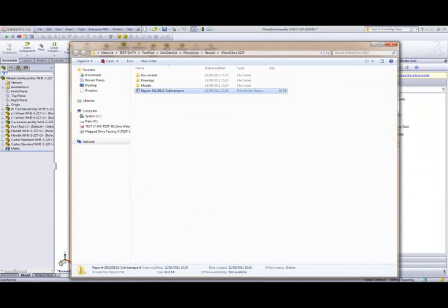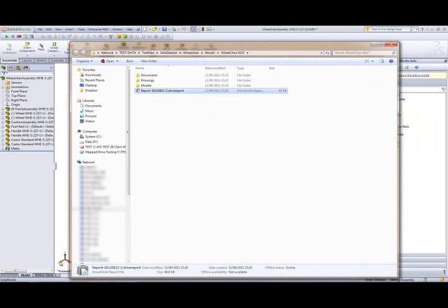In the rules setup for this particular project, we have created separate folders for the documents, the drawings, and the models.